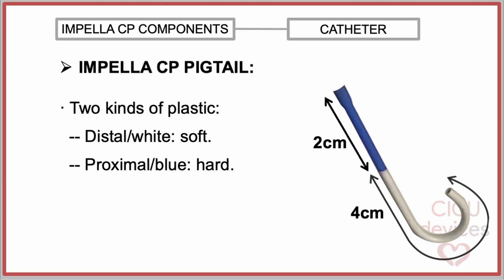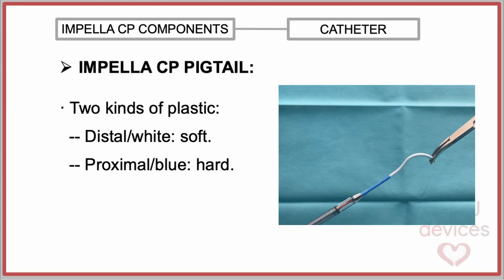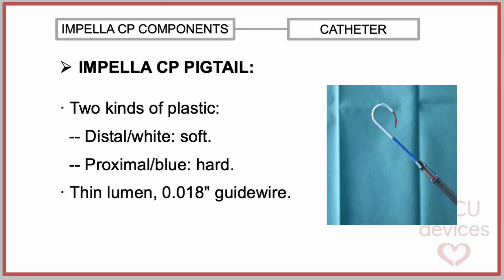The memory plastic returns to its curved shape. In contrast, the two more proximal centimeters are made of a blue, hard, rigid plastic designed to improve stability. In this clip, we can observe the two different types of materials. Additionally, it has an internal lumen that enables the presence of the easy guide, which facilitates loading the catheter over the guide.